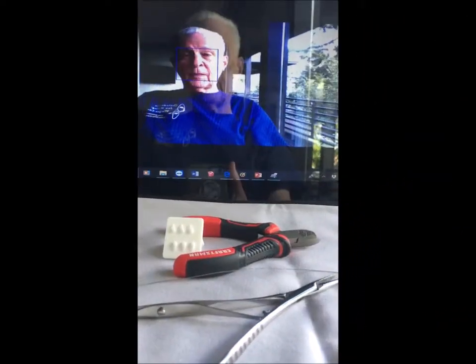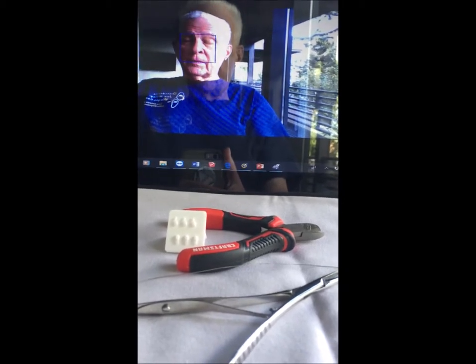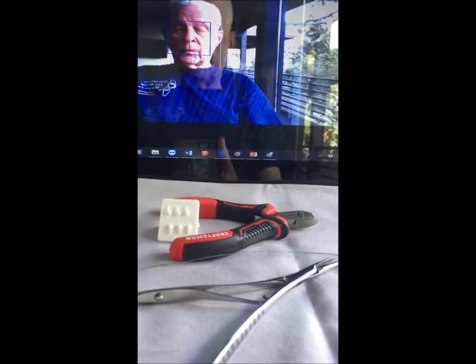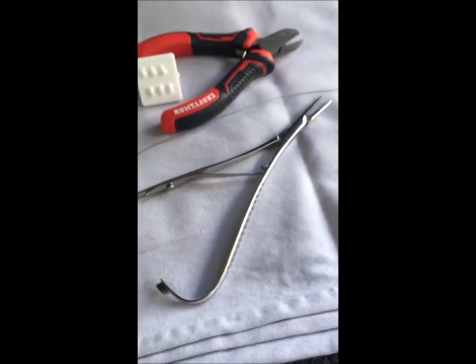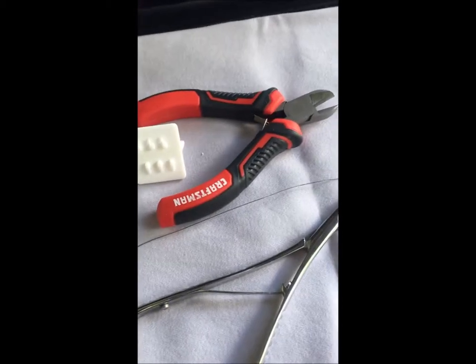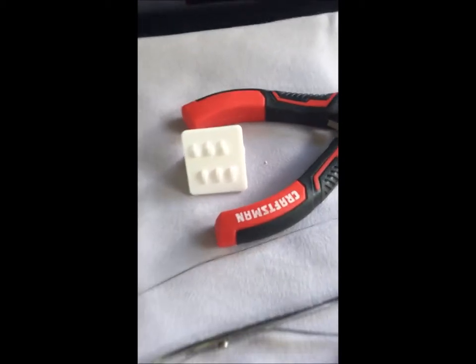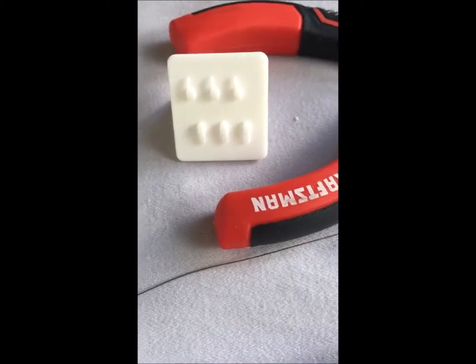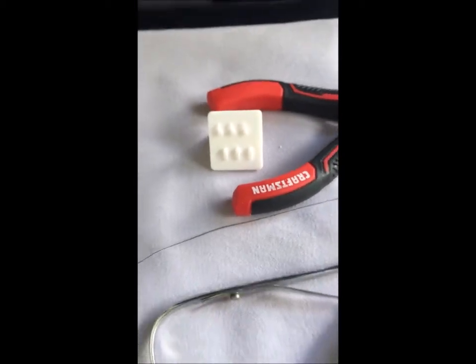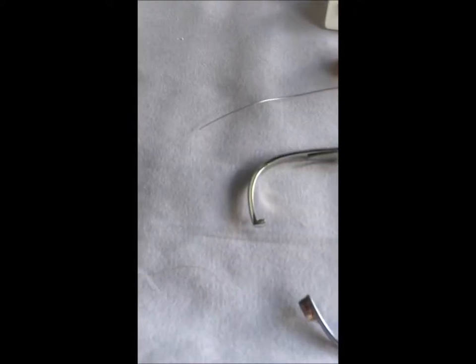To practice wiring and unwiring, the patient will need some instruments. Those include the wire twisting instrument — the twister — the wire cutting instrument, the demo tool, and some wire.